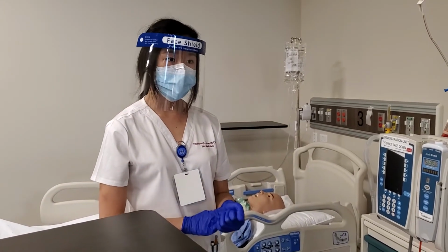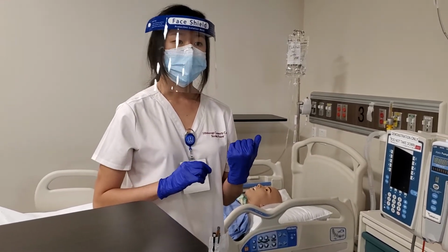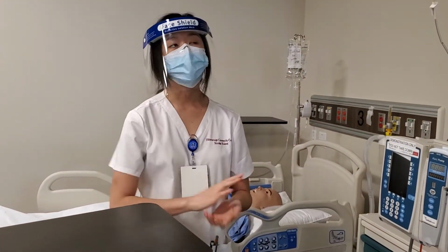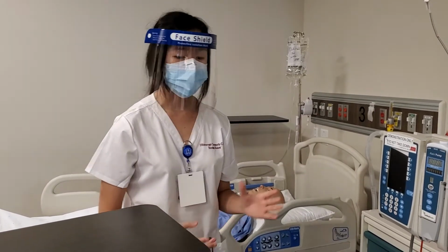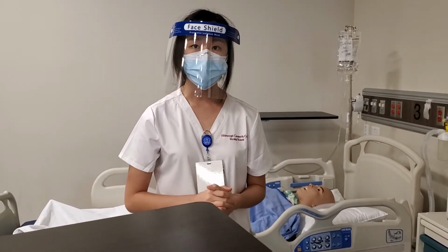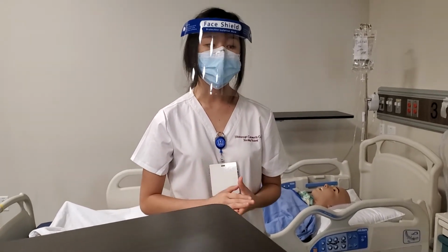And then after that is finished, then we can remove our gloves, and then perform hand hygiene, discard the supplies, and then leave the patient safe and comfortable. And then we will document that a blood transfusion was administered and how the patient received it, and also the units of the bag.